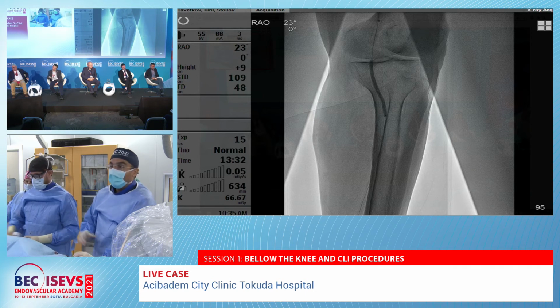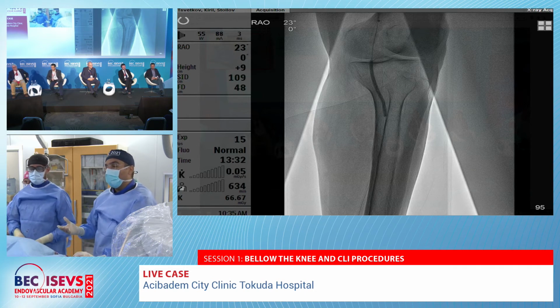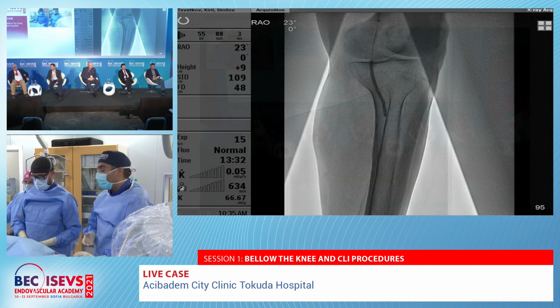Okay. If you had the opportunity to do this, would you use drug-coated balloons for below the knee arteries?